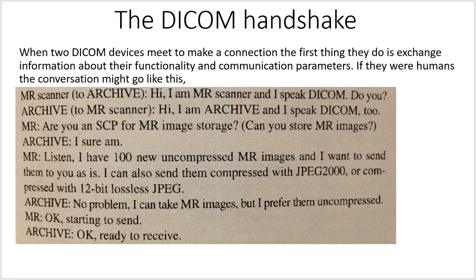So keep in mind how chatty that is. That's just to make the connection and to figure out what format they're going to send them in. So a lot of times people will click to download an image or click to open up an image in the PACS system, and they have a hard time understanding why it takes so long.